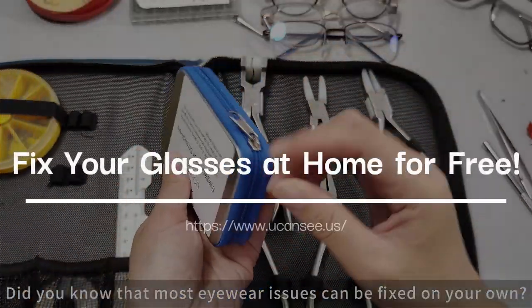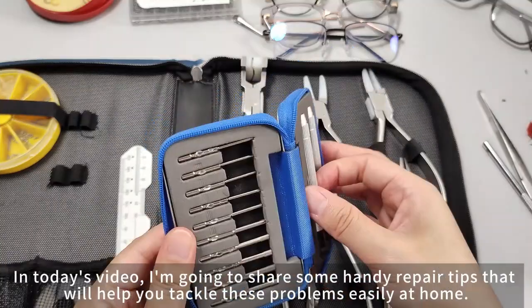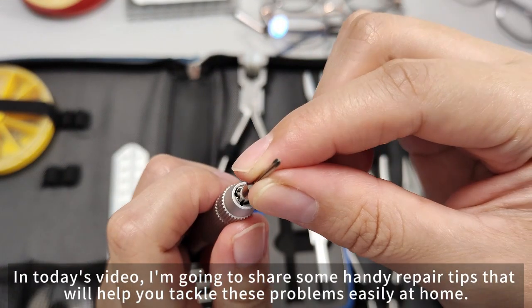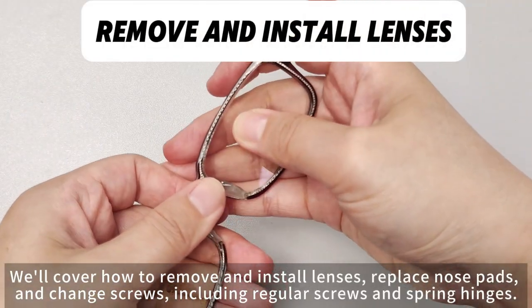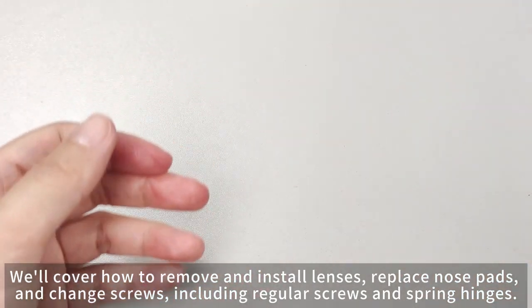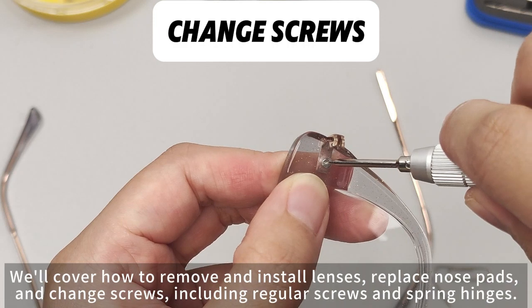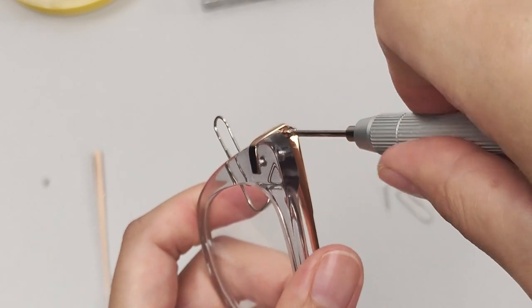Did you know that most eyewear issues can be fixed on your own? In today's video, I'm going to share some handy repair tips that help you tackle these problems easily at home. We'll cover how to remove and install lenses, replace nose pads, and change screws, including regular screws and spring hinges. Let's get started.